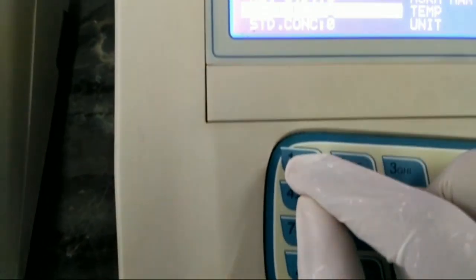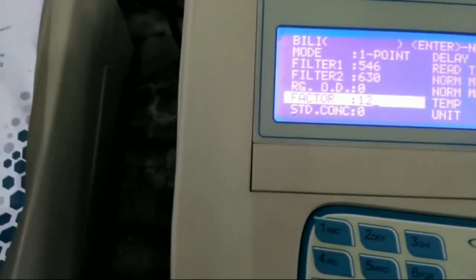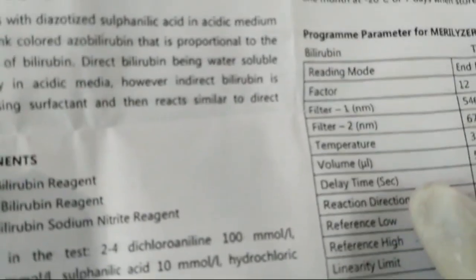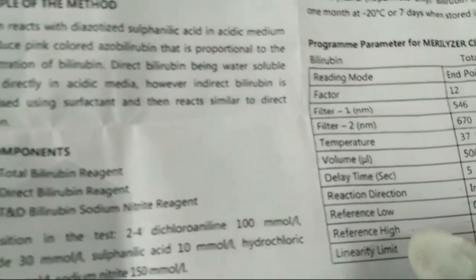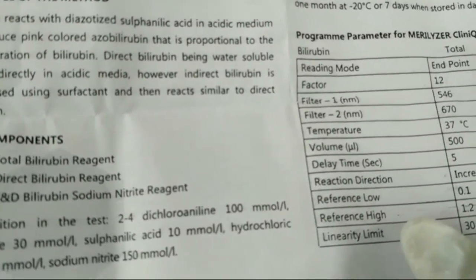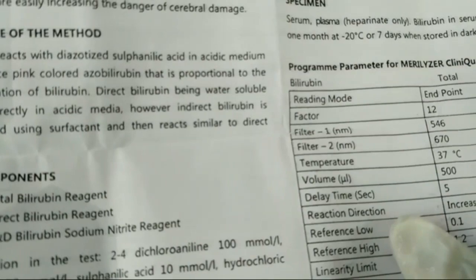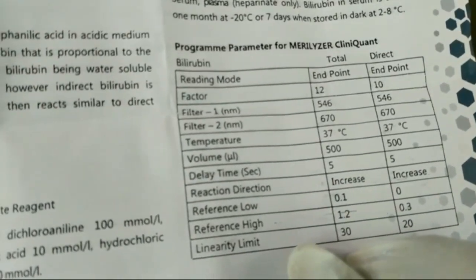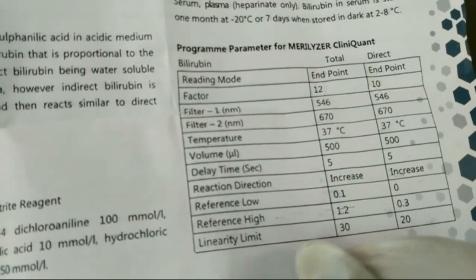We can enter the factor manually. The factor is 12 — we will enter it. For the standard concentration in this program, the standard is not supplied, but the standard concentration is 10, so we have to enter 10.